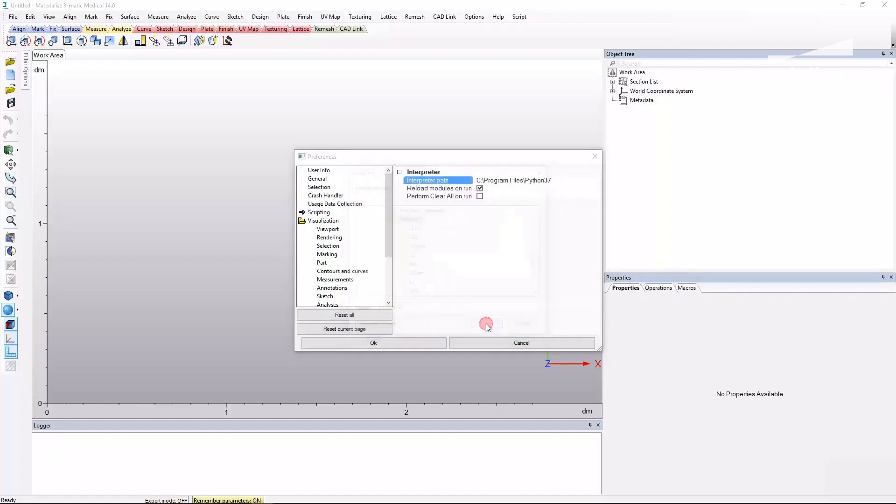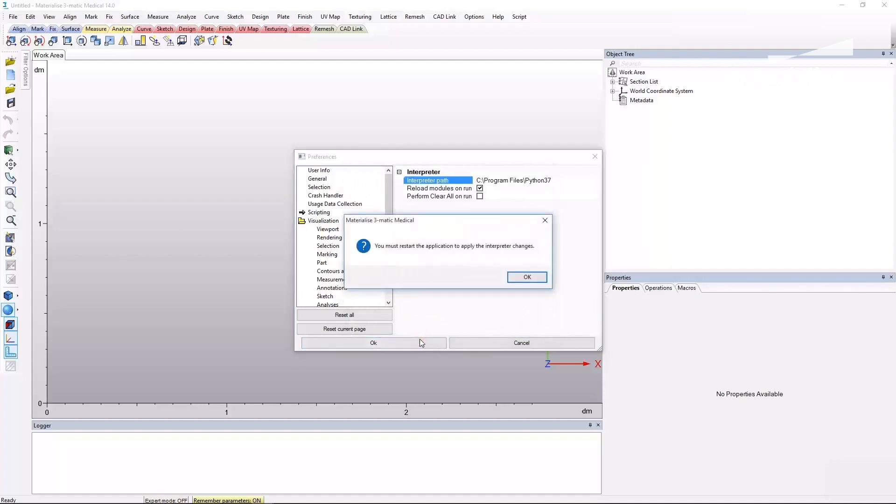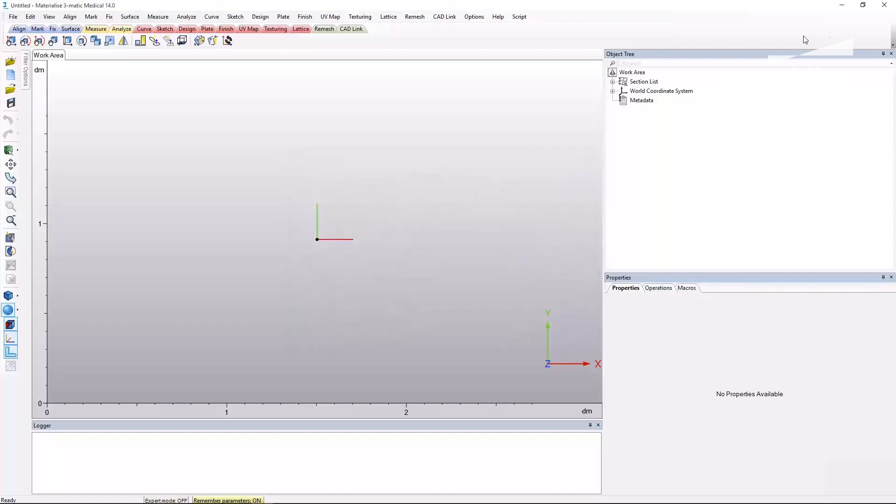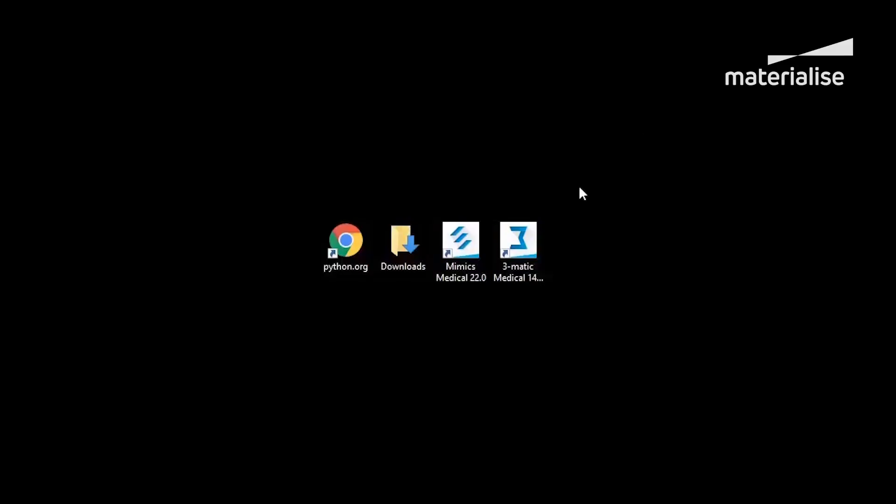Click OK to close the window and apply these new settings. A notification window should appear to inform you that you must restart the application to apply these interpreter changes. Close and restart 3-matic to do so.